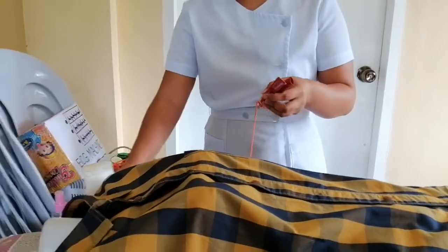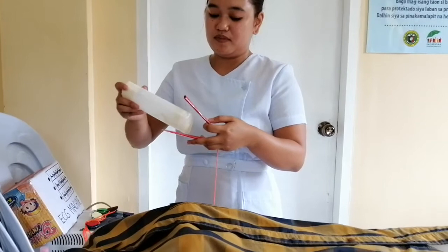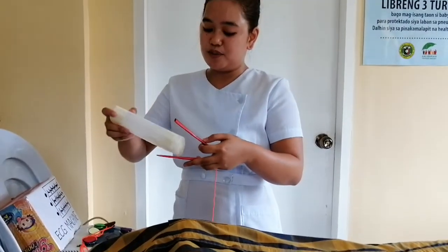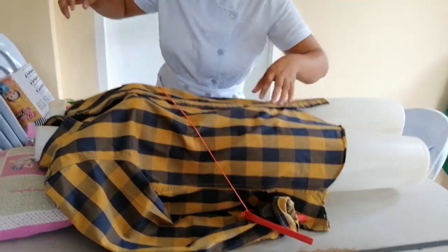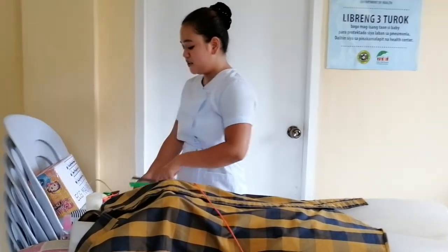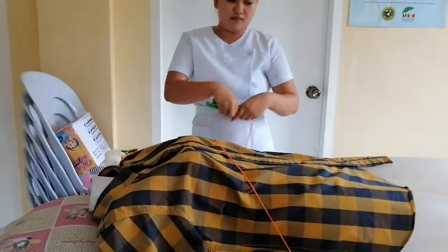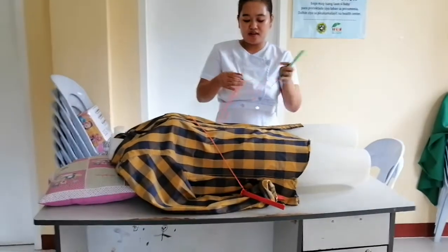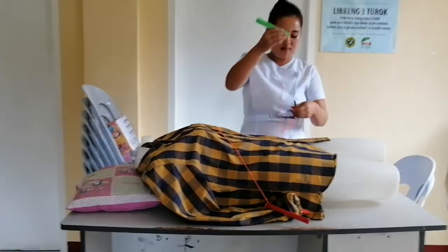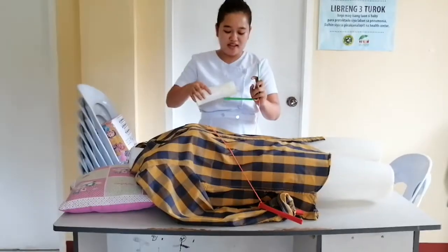And also the red one will be placed on the right arm of the client. So place an electrogel. Do not forget to put it. And we also have leads for the lower extremities. So the color green will be placed on the left leg of the client.